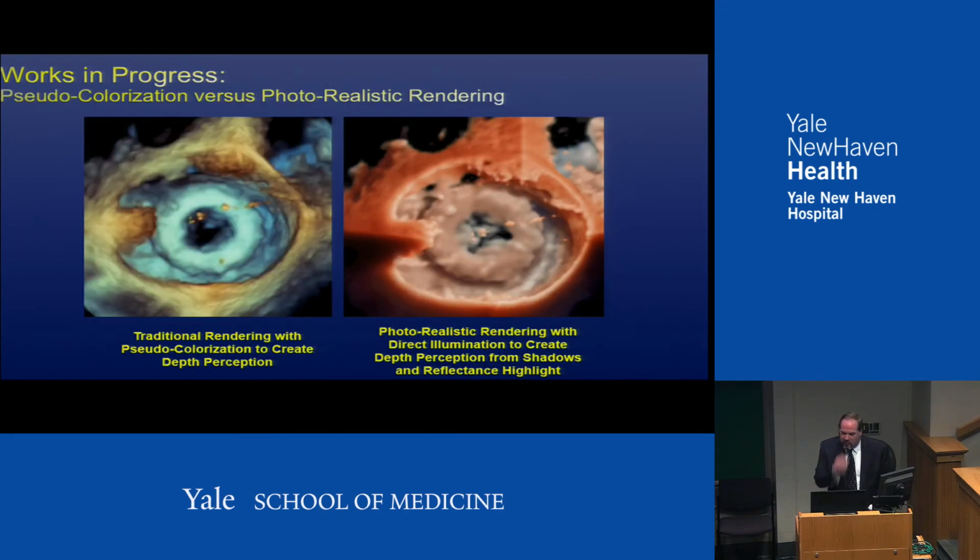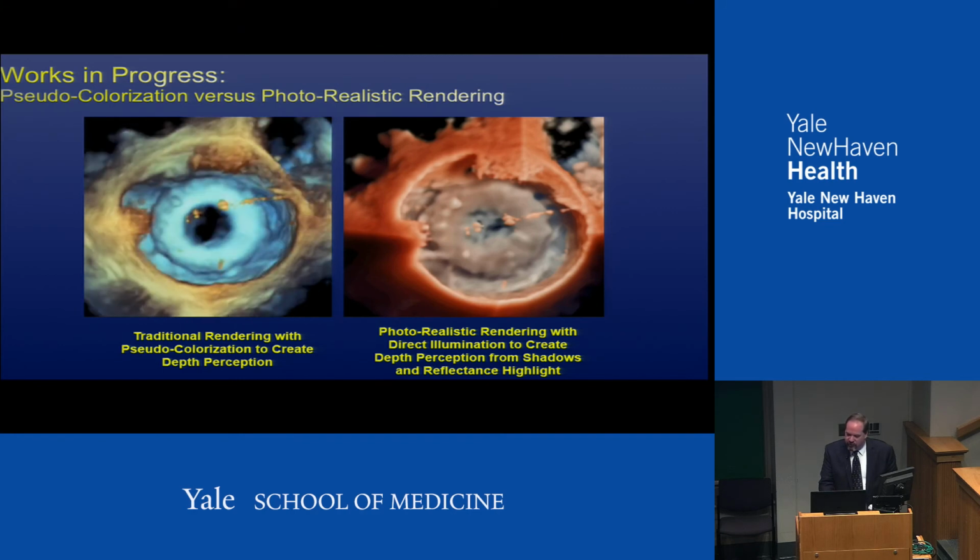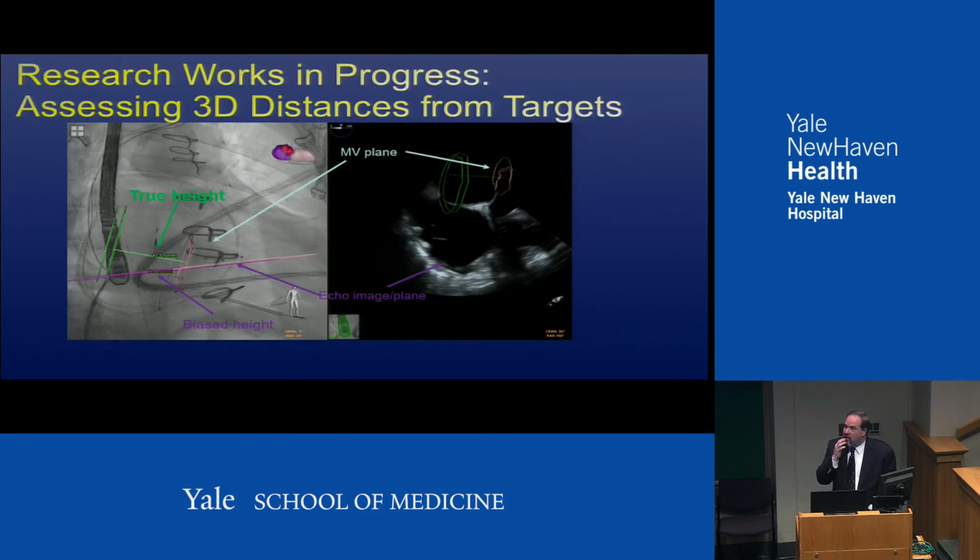And how do we orient that? This just shows the photorealistic preparation to be able to change the view. We can also do some things in this case in which we can use tools. So here on the right-hand image, we've segmented out the mitral valve. And if you see the fluoroscopic view, the mitral valve is there in pink. But what we've done is then set a mandatory distance with 2 lines that actually moves with the mitral valve, but that distance is set so that we actually know it's sort of the appropriate zone to puncture.